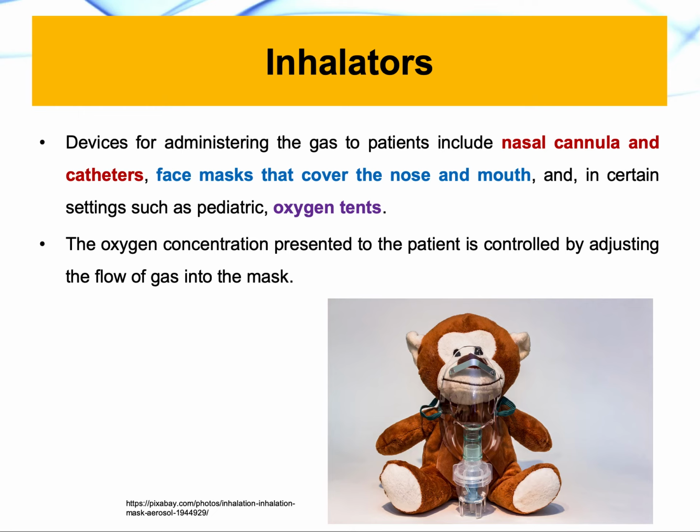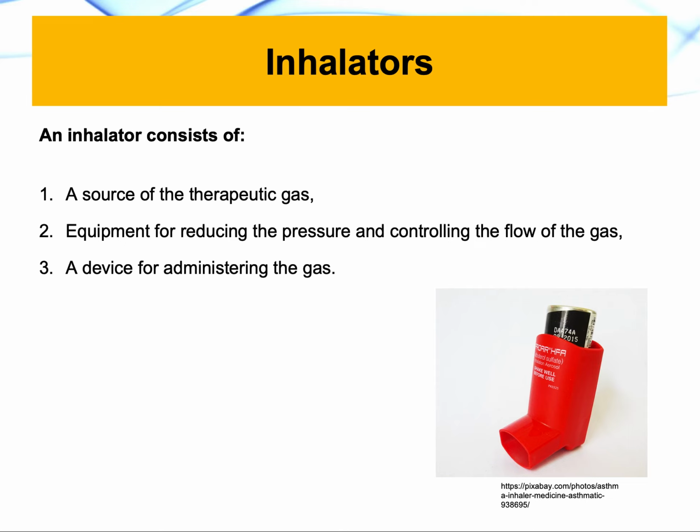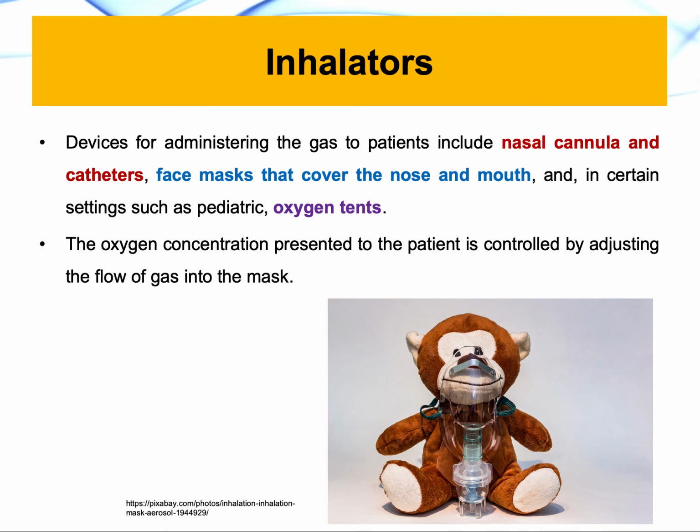So I just wanted to make sure that this is also a very important component of the inhalator for engineers to design and optimize. And because of the pandemic and COVID, a lot of interest is now shown in designing better components for the inhalators, specifically the device for administering the gas and the therapeutic agent.